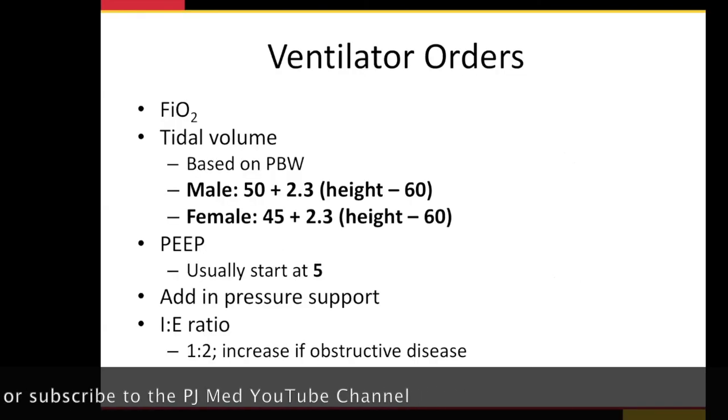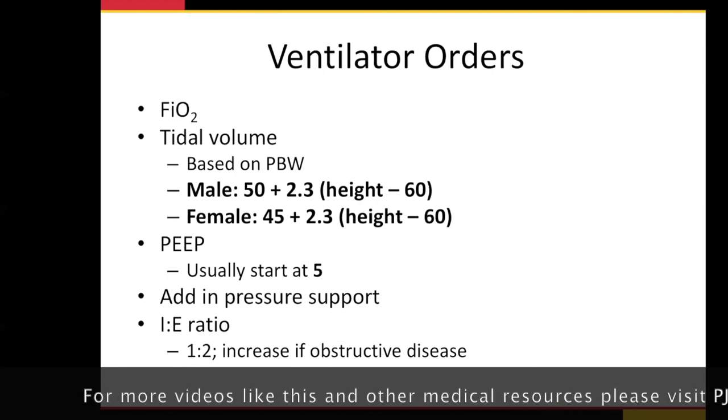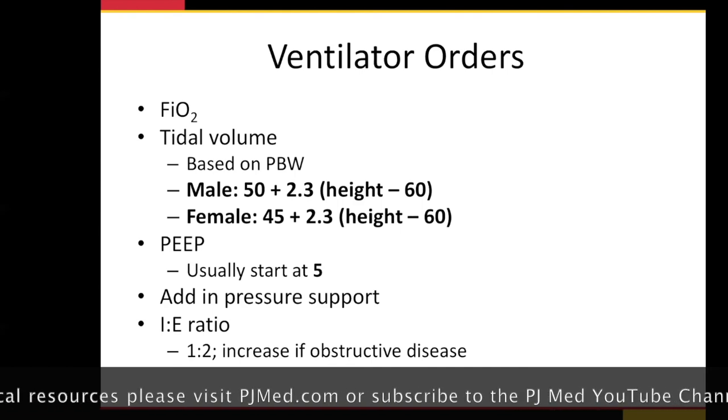Okay. Let's talk about management. So when you go to set up your ventilator, you're going to have a lot of knobs, and don't be intimidated. There's only a few things you can really manipulate. Even at the highest levels of this critical care business, there's only a few things we can manipulate, and this is really it.